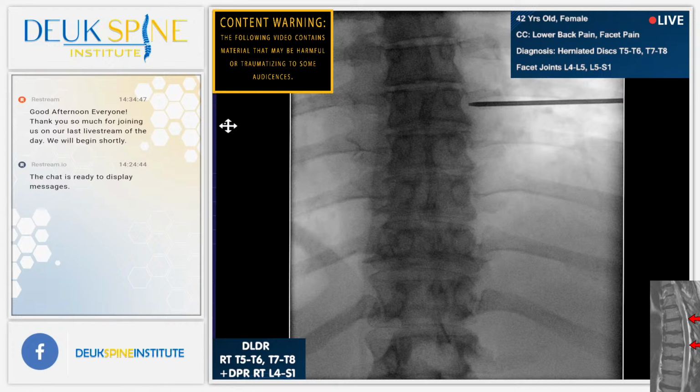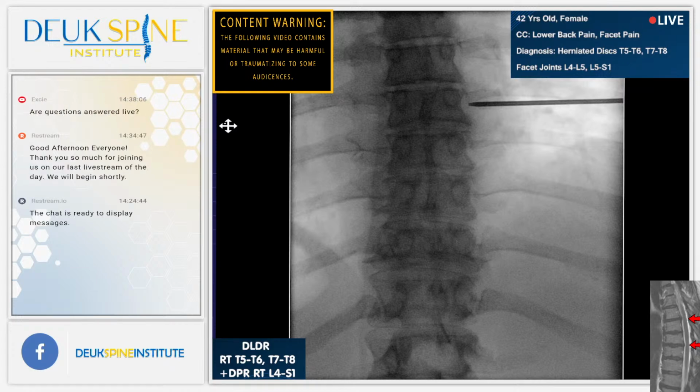We're doing 7, 8. So we're doing this disc right there, right above that. Maybe you can bring the base a little bit closer so I could see a little bit better. Yes, sir. A little bit to you. Yep, perfect, that's good. All right, so our first disc is right there, 7, 8.